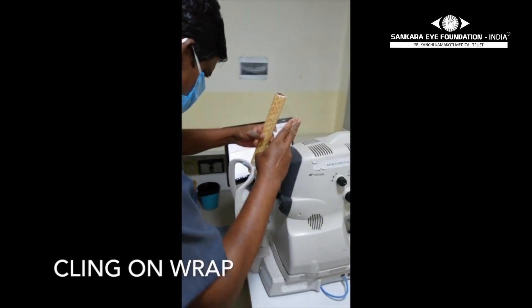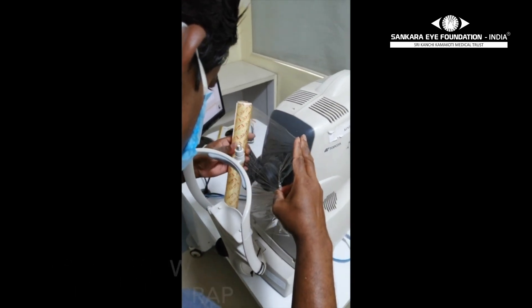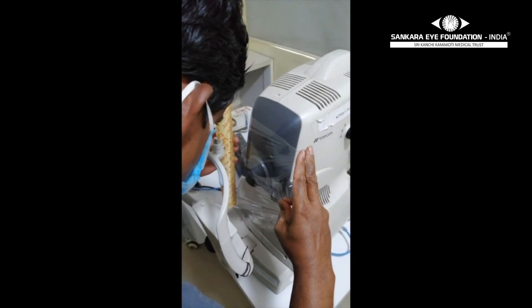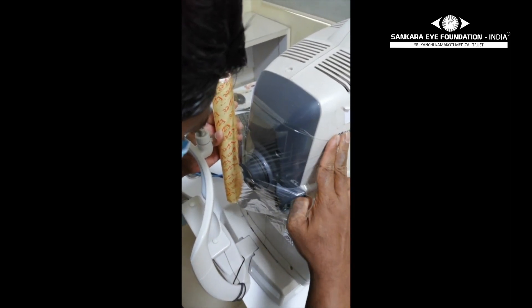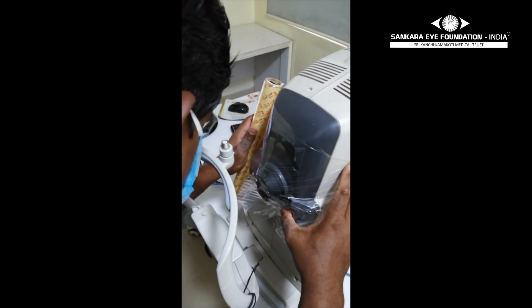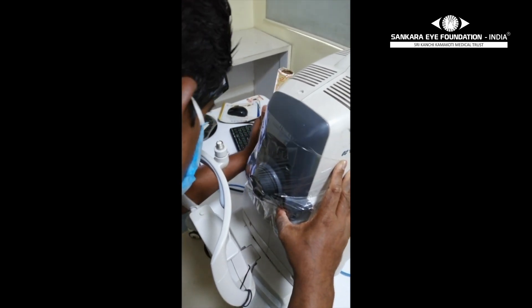Take an adequate length of the Cling Wrap and cover the front, including the lenses and the sensors of the OCT machine, attaching it to the sides of the machine. The entire process of covering takes hardly 5 minutes to complete.